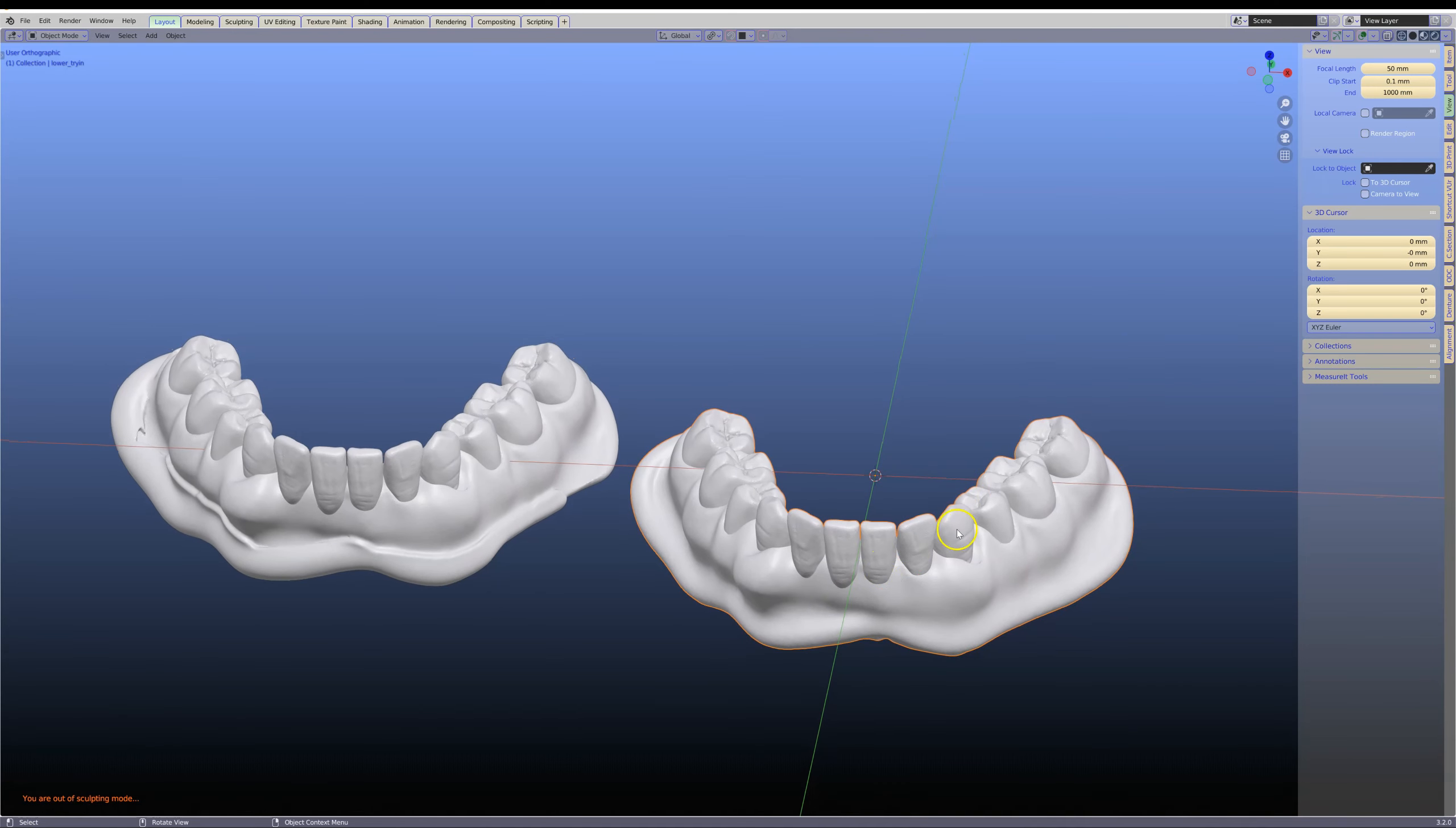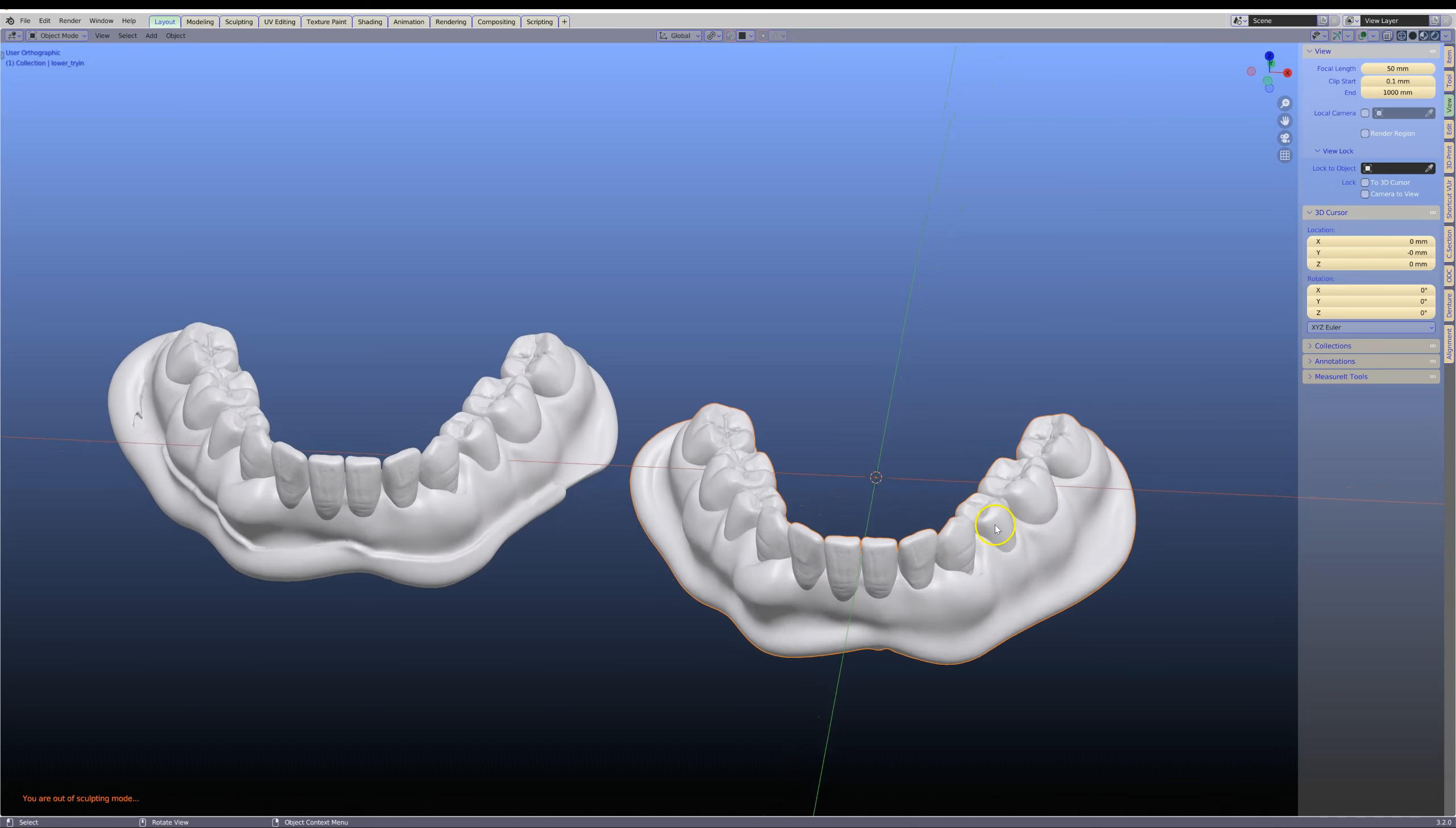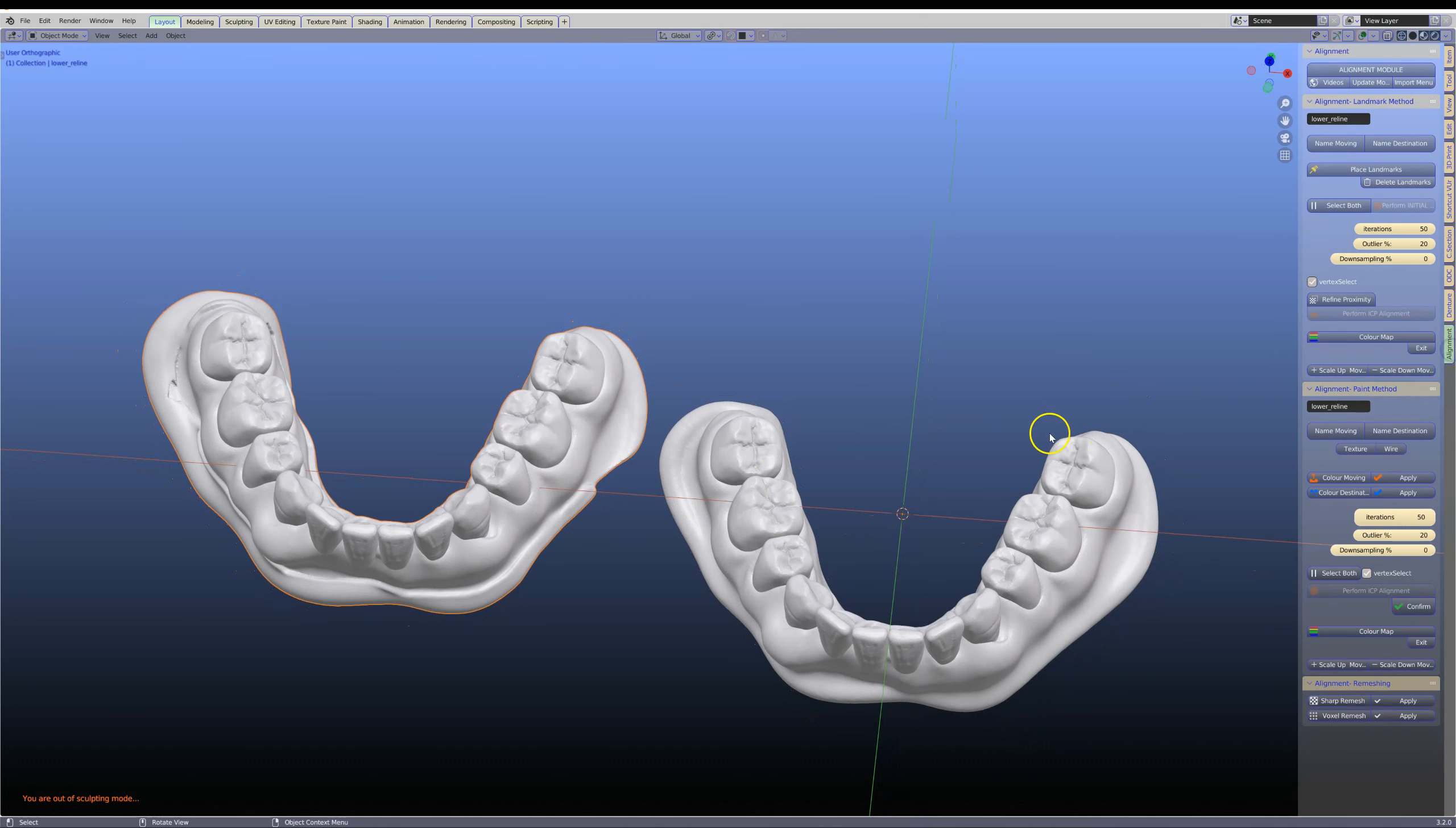The first thing we need to do is import the STL file that was printed originally and import the STL file of the reline. This may not be in the correct location, so in the alignment module, we're going to quickly align these two over the top of each other.